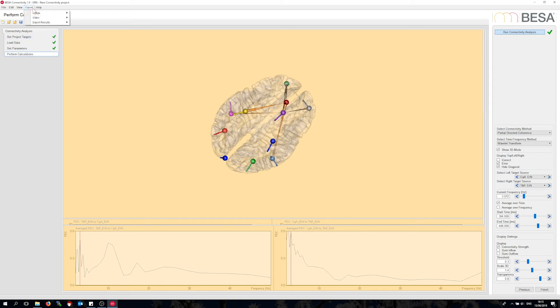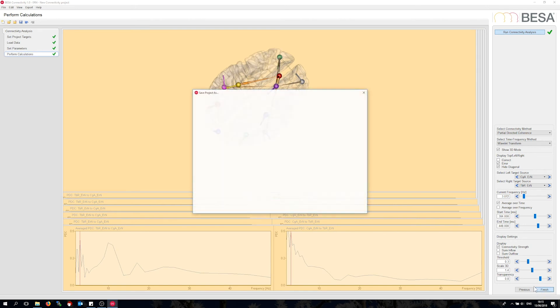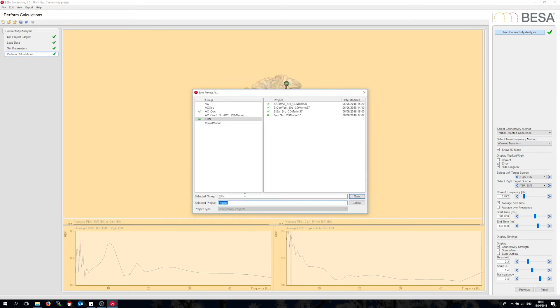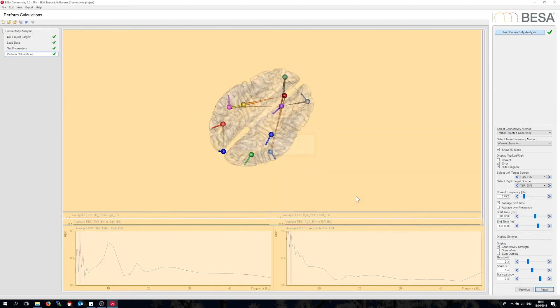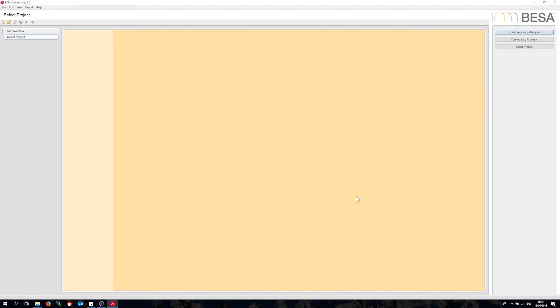I can export these results as connectivity data to ASCII files to import later into MATLAB or other packages. Now let me finish this project and save so I can reload the results at any point in time later. This concludes this video session where we explore different time frequency methods applied to several connectivity methods for two different conditions all in one go. Thank you.